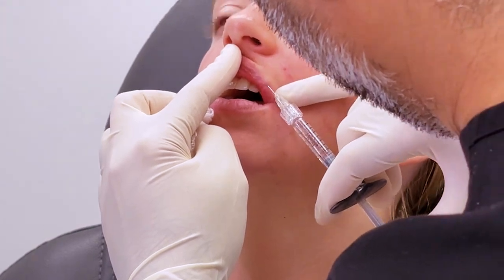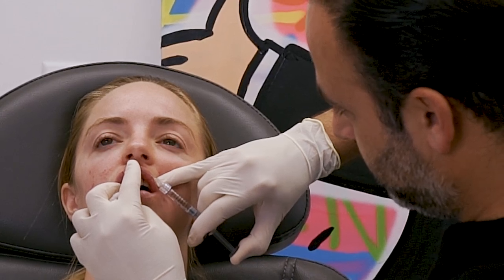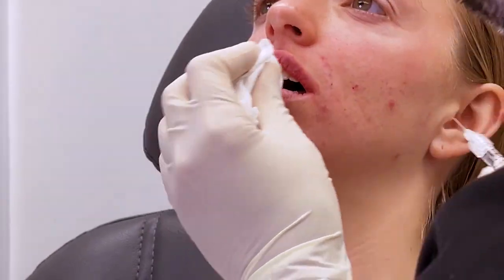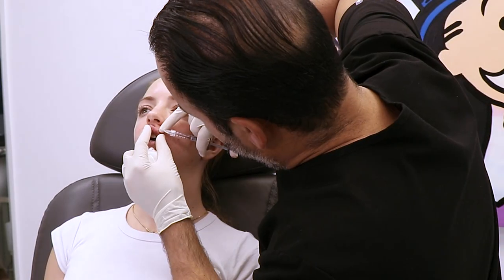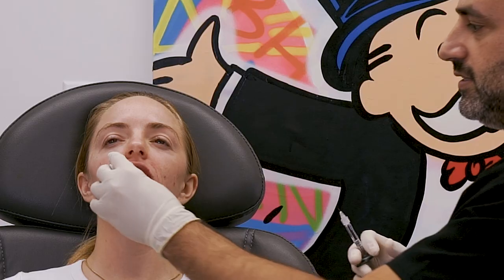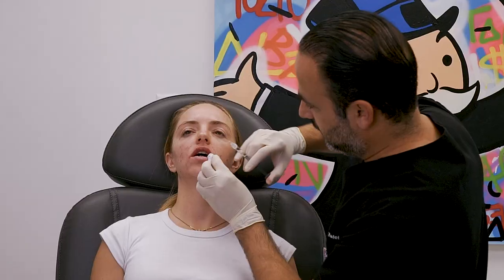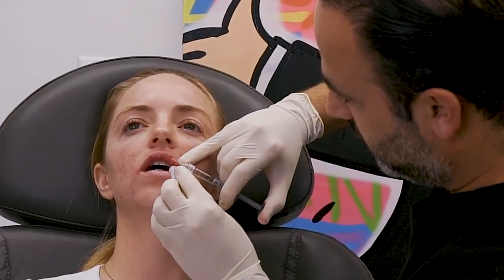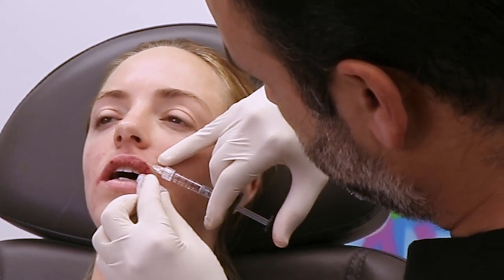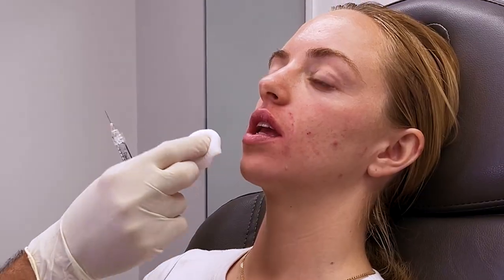She has beautiful tissue planes because they haven't been traumatized before. People who have been filled or dissolved multiple times — it's all damaged and much less predictable where the filler will go. Hers is behaving. I'm going to do a little vertical injection over here into that crease. You don't want to get rid of the sulci laborum — it's natural, like having a fingerprint, those little wrinkles — but it's good to soften a couple if they're dry or indented. We're going to give her just a little bit at the cupid's bow peak and that's it. Little face, you don't want big giant stupid lips.